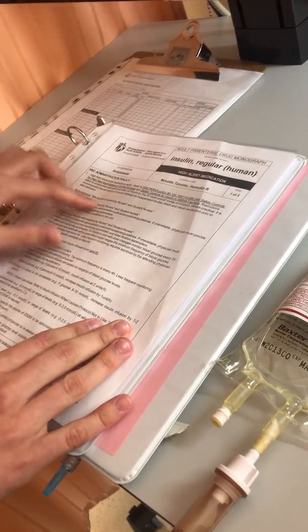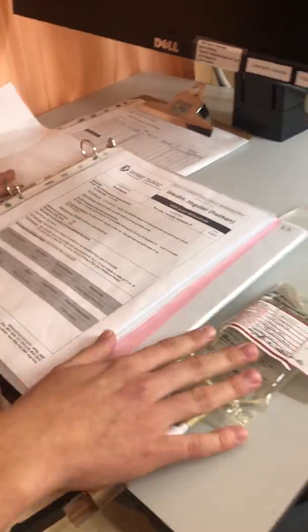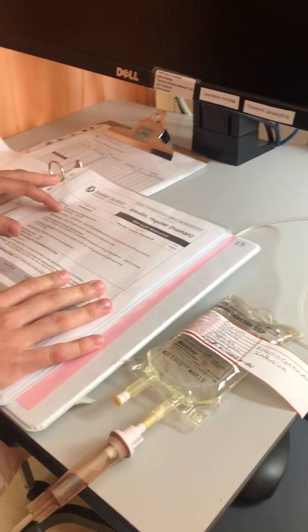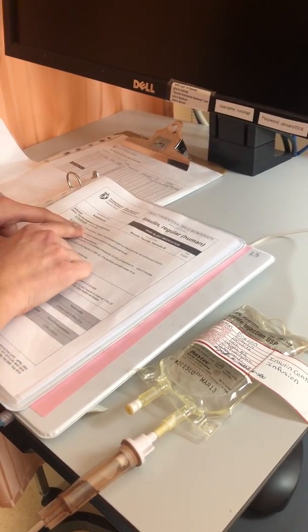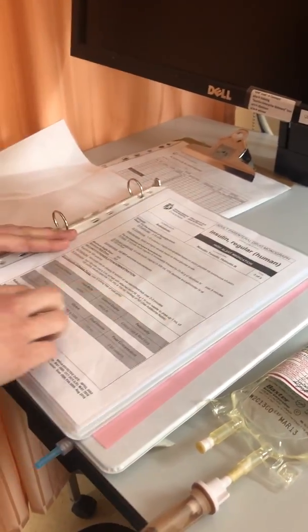So it's for insulin, Humulin R. It can be given by a student nurse. The nurses that prepared this also checked that the insulin was not expired. So for IV continuous here, 1 to 10 units hourly. So he was within the safe range at 2 units per hour.